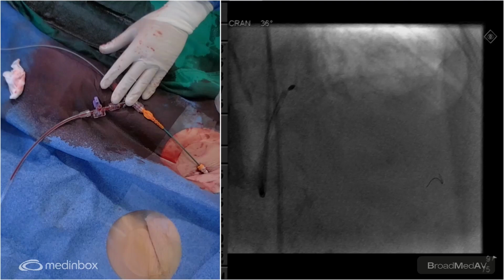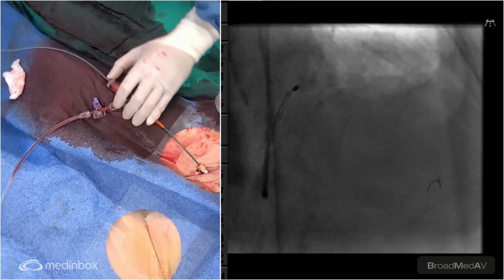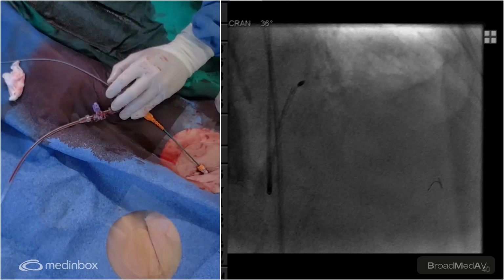Now, this is in a 7 French. It might be easier just to glide it out. It's super smooth that it went in. Let's see. Just glide it out for fun. Arjun, you want to do this, or you want me to do this? Yeah. Spin, break the feet, walk out.